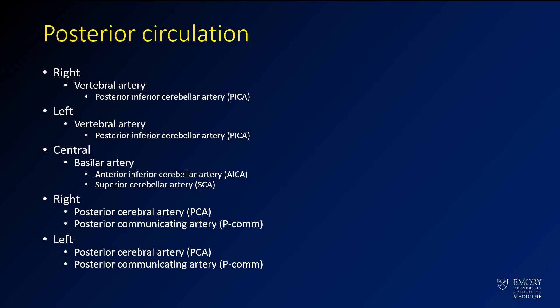Once you're finished looking at the anterior circulation, I move on to the posterior circulation. I have a similar pattern — I move from right to left. I'll start by looking at the right vertebral artery and take a look at the PICA as it comes off. Then I'll go back down and look at the left vertebral artery and its PICA as well. I'll look at the midline structures, mainly the basilar artery, with its two main branches — the AICA and the SCA. Then at the basilar bifurcation, I'll look at both posterior cerebral arteries and look for a posterior communicating artery, first on the right then on the left.